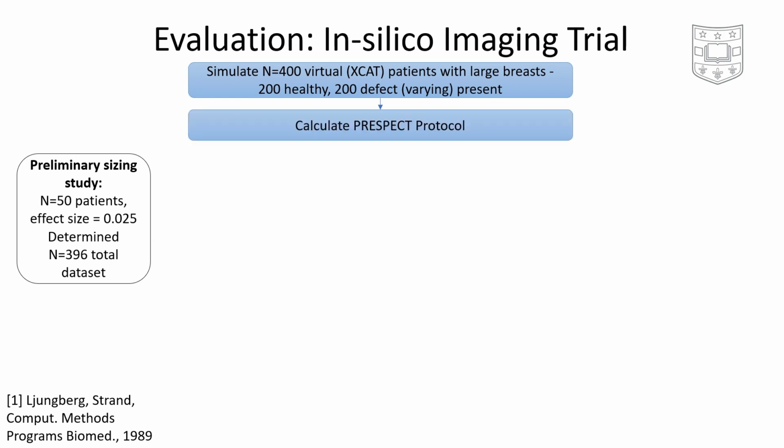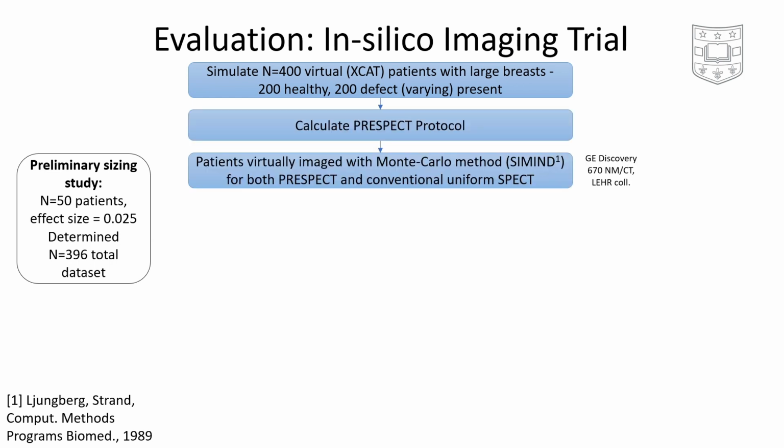From here, we calculated the PRESPECT protocol for all patients, and then imaged them virtually using a Monte Carlo simulation method known as SIMIND for both PRESPECT and conventional uniform SPECT.